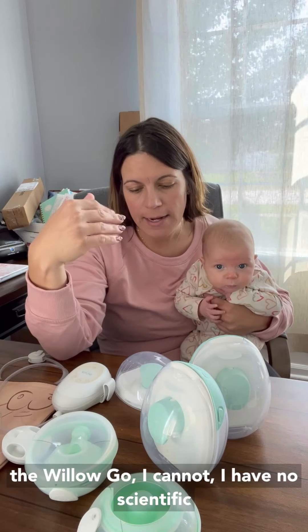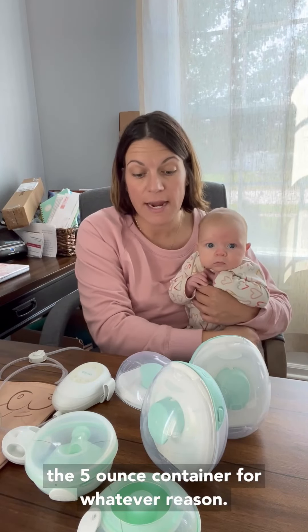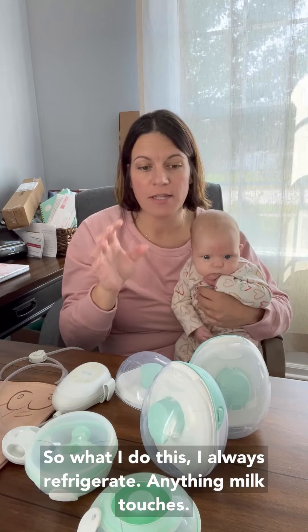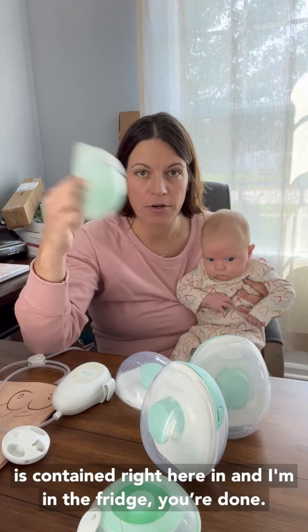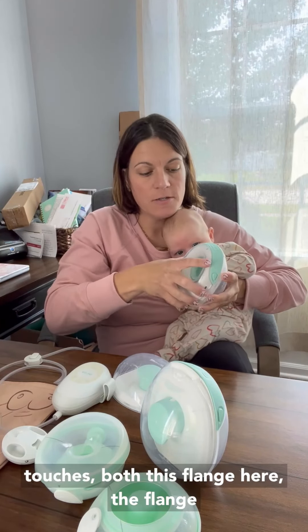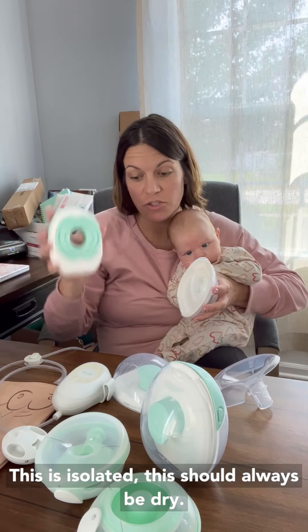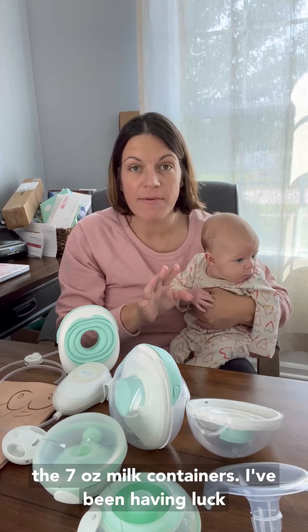Now, the thing with the Willow Go. I have no scientific findings here — I just don't have luck with the 5-ounce container for the fridge hack. For whatever reason it just doesn't work. But I have been having luck with the 7-ounce Willow Go container. I always refrigerate anything milk touches. With the Willow Go, everything is contained right here — in and done, in the fridge. You've got milk that touches the flange, but not the motor or the diaphragm — this is isolated and should always be dry. So I refrigerate the milk container and the flange. Those go in the fridge for me, and the 7-ounce has been working.